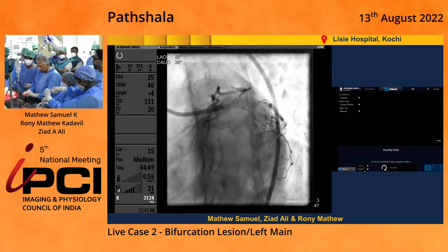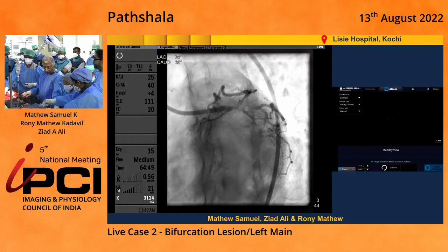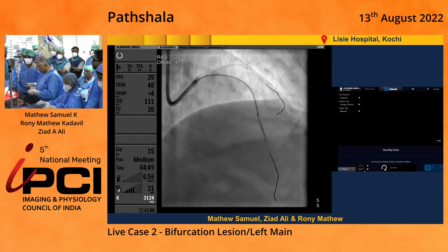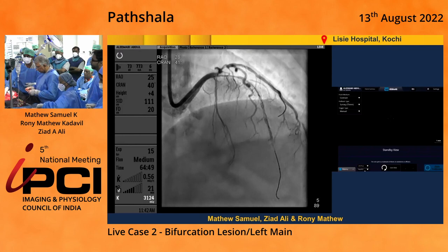You can also see that there's circumflex disease. This is a very large ramus supplying the lateral wall. The circumflex is actually an anomalous vessel. So the first thing we wanted to do was to show you how to do an OCT in a very tight lesion, which we did.